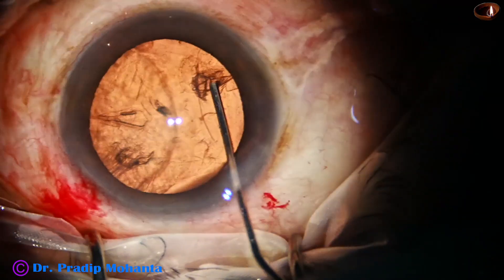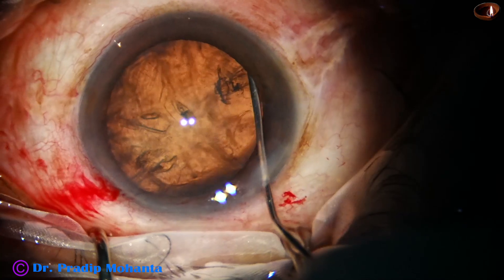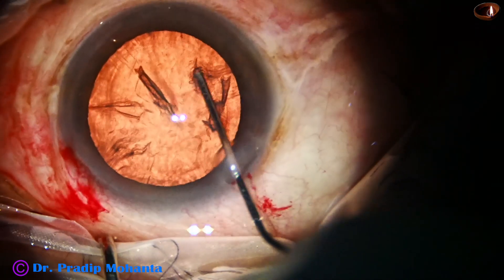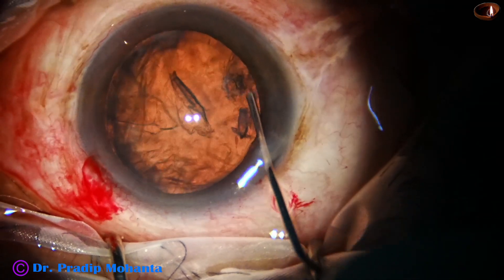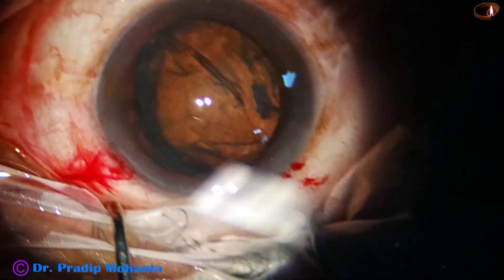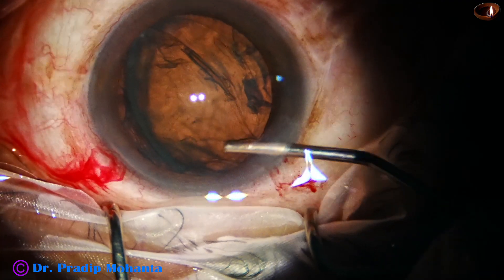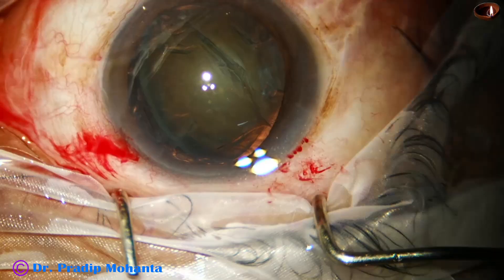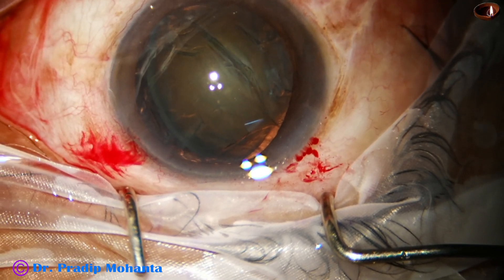After hydrodissection and tapping the nucleus, some more fluid is injected like this, and one part of the equator — in this case the left side — has prolapsed out of the capsular bag. Some more viscoelastic is added.